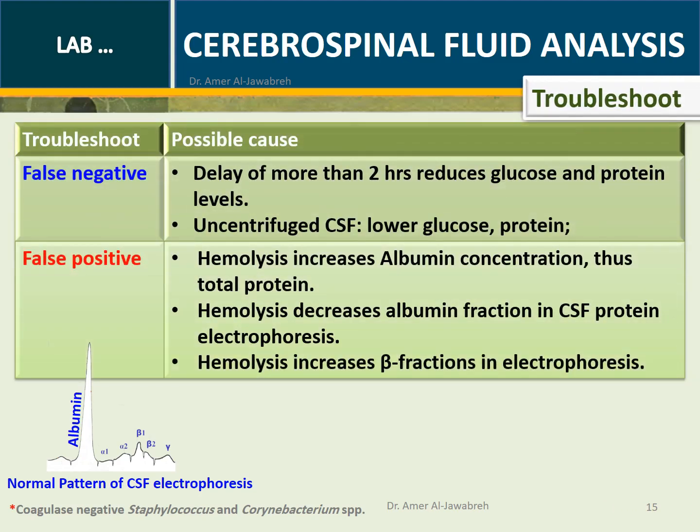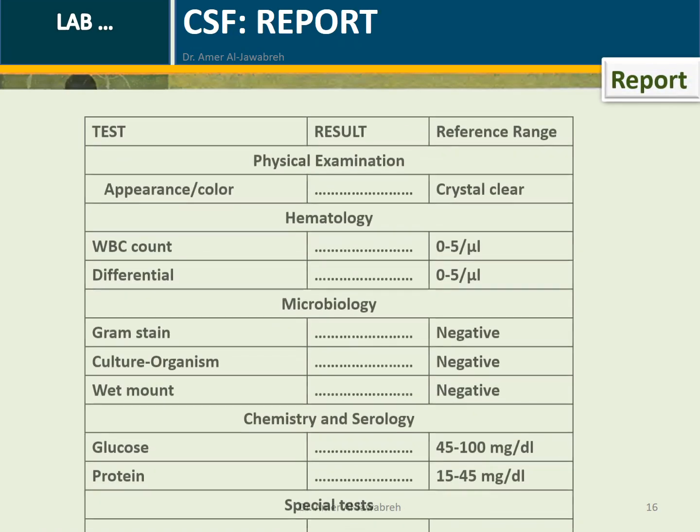Troubleshooting. See the following table for possible troubleshooting. Use the following form to report results.